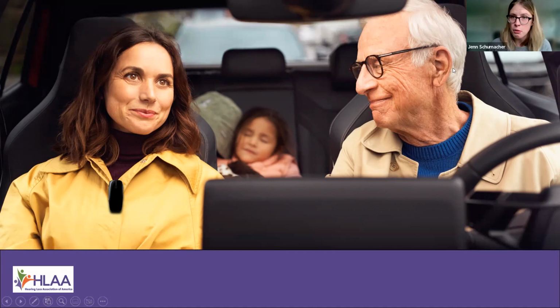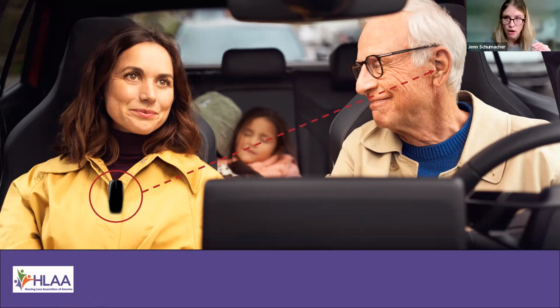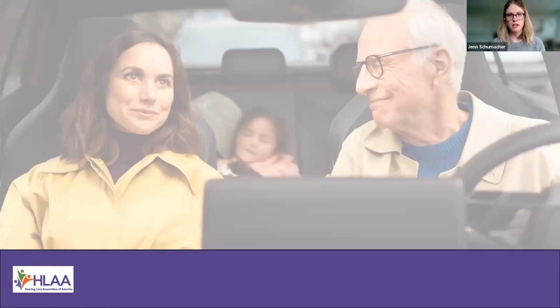Essentially, if we have this gentleman here in the car, he's wearing hearing aids. Let's say this is his adult daughter. She wears the multi-mic on her lapel, and her voice goes into that microphone and directly streams using Bluetooth or wireless technology right into his hearing aids. So this is an amazing way to cut out background noise, because the microphone is right next to the mouth of the daughter who he wants to hear. By reducing that space and having her voice go right in there and then just streaming it into the hearing aids, you can cut out so much background noise.